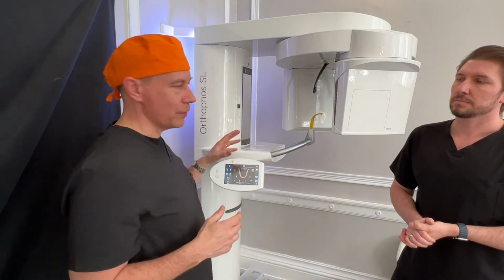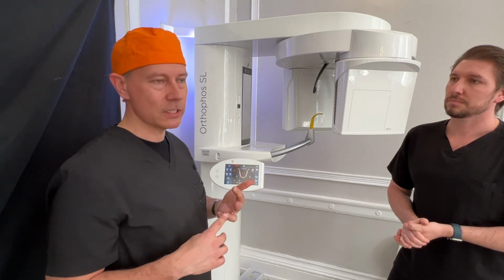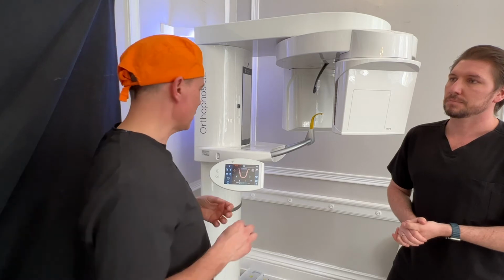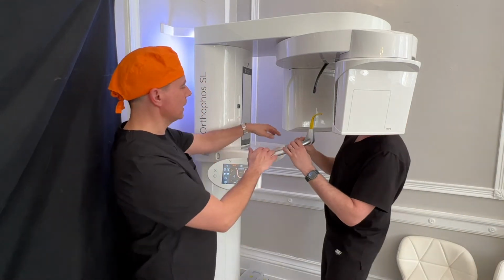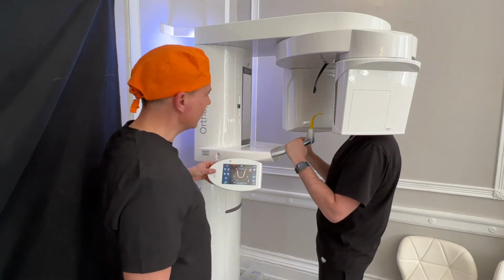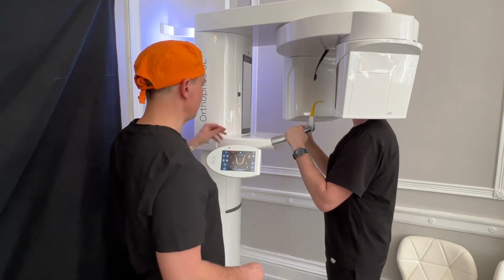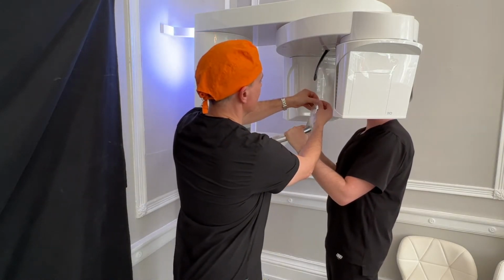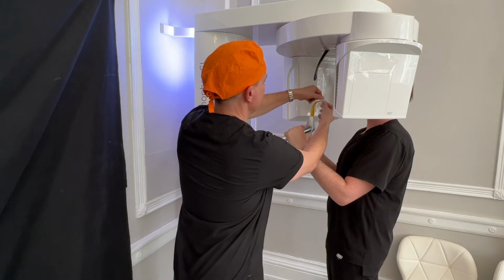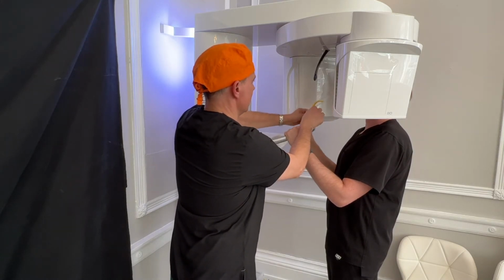It is important that we line everyone up correctly though, depending on the size of the patient and the area you're wanting to expose. So we're going to have a look here today. First of all, we get the patient in, let them hold on to the handles, and then we just move this up so it's a comfortable height so the patient can step in with small steps. We're going to put a little bag onto the bite for today. So that sits there like so.